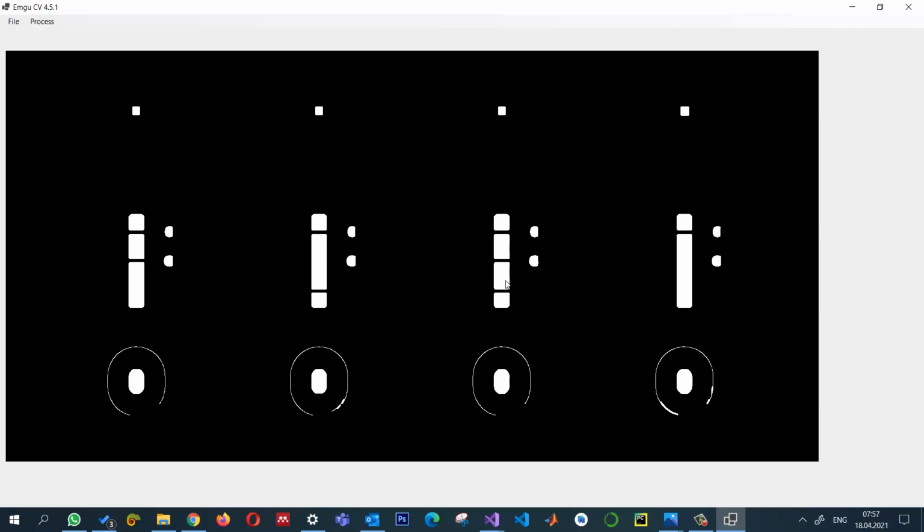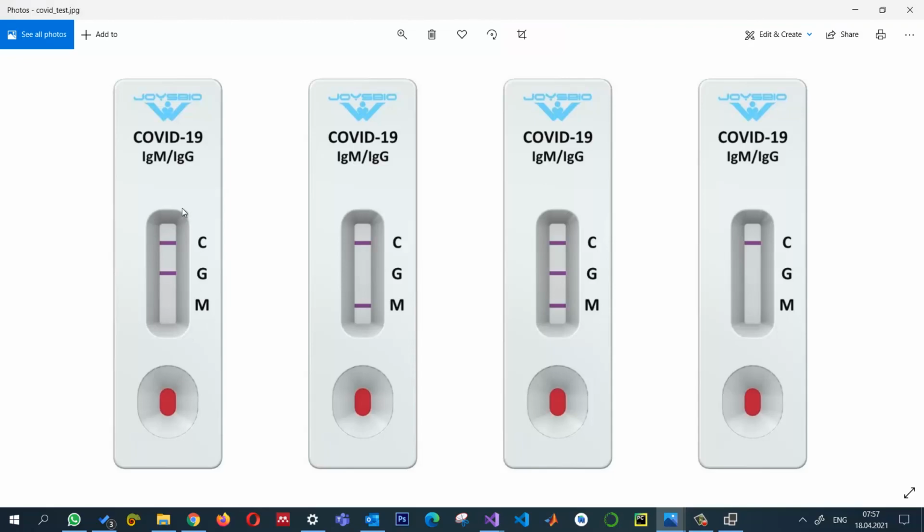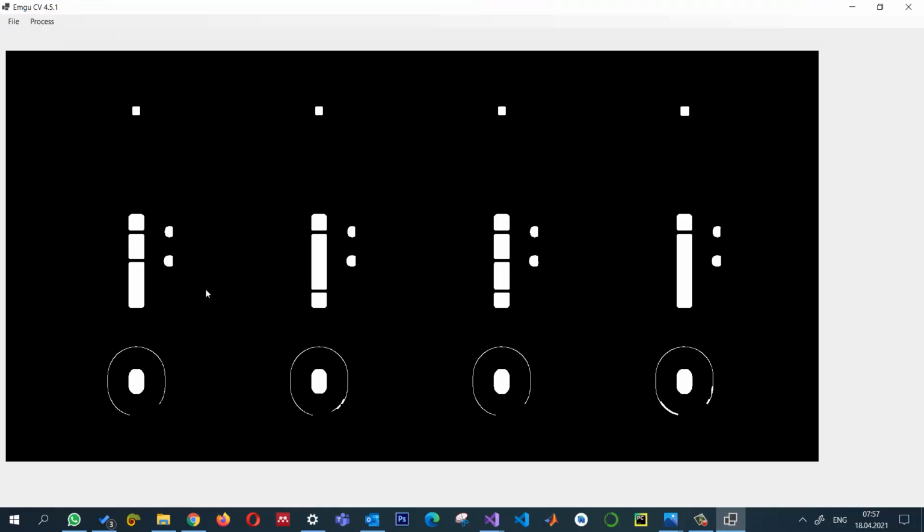So one thing that I can do is further process this image. And if I do a dilation with a structuring element that is longer in height, then it will combine these together. So we will have one longer contour inside it. And I'm basically interested in inside of this one. So I'm only interested in identifying this part only. So if I get a longer one, then I will be able to remove the rest of them based on the height. It has a bigger height and the ratio will be higher, so then we can remove the rest of them.